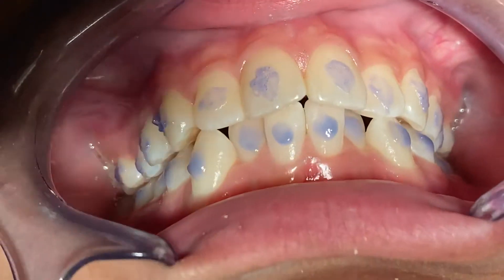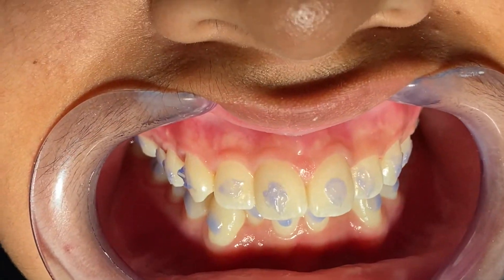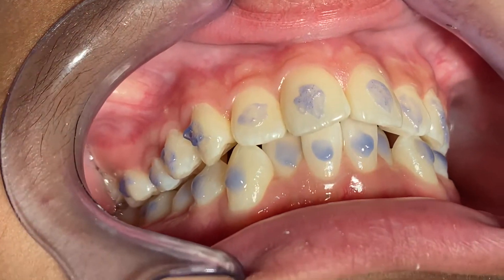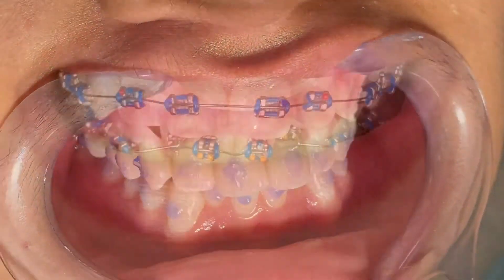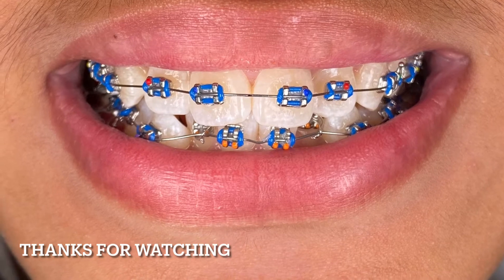It's very important to determine in advance. I see assistants or dentists put so much etch everywhere on the facial aspect of the tooth — this is not a good idea.